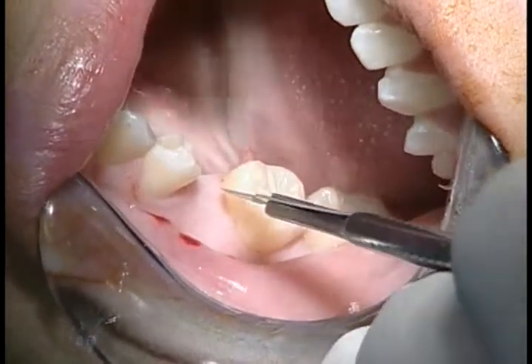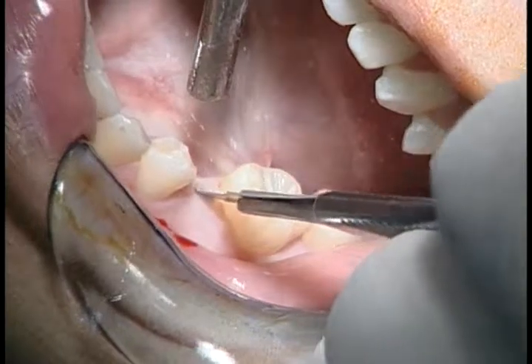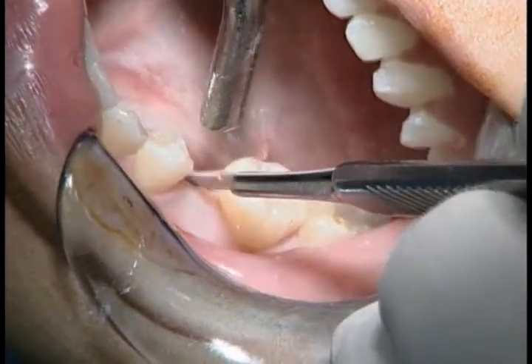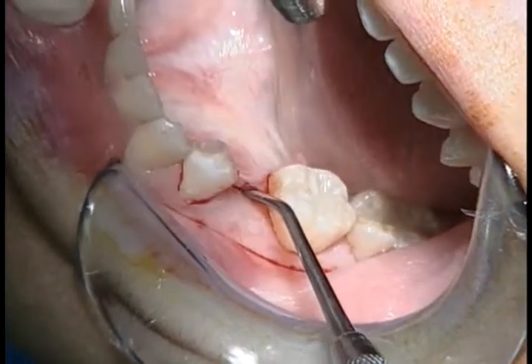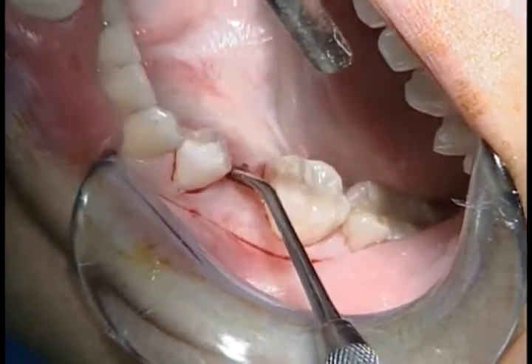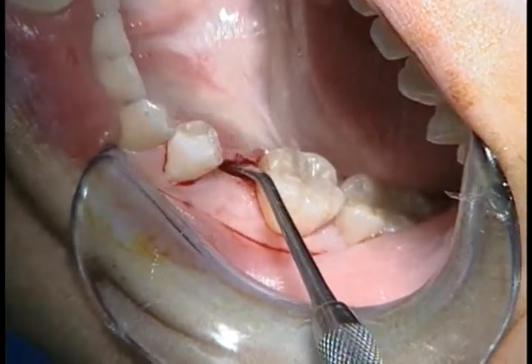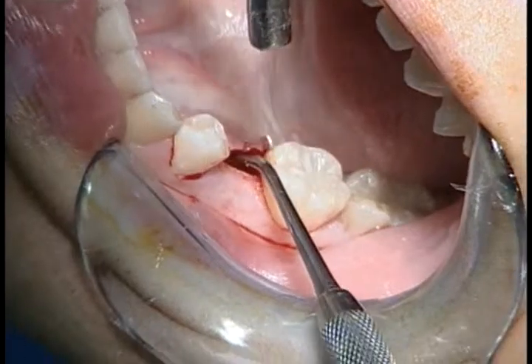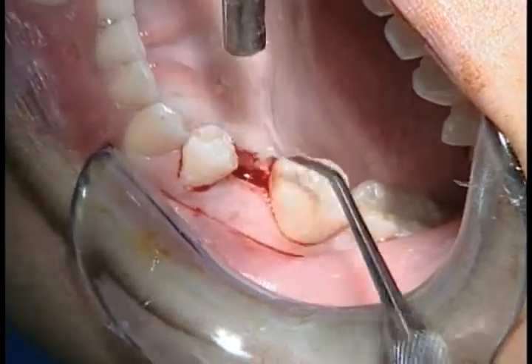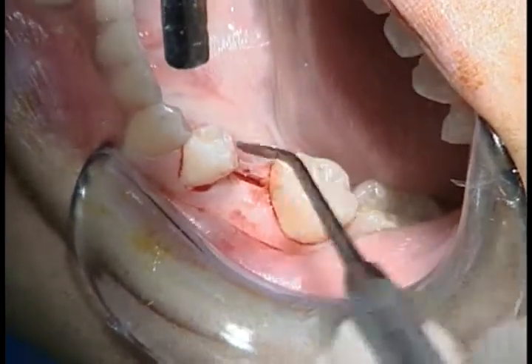Once the incision is completed, the flap is elevated. While there are several types of periosteal elevators available to the surgeon, and to some degree the type of elevator is a matter of personal choice, the Woodson type elevator shown in this video is a very good elevator for the initial release of the surgical flap. Much like the incision was a full thickness incision, the reflection of the flap must be a full thickness reflection. Care should be taken not to tear the flap into layers when reflecting the tissue.